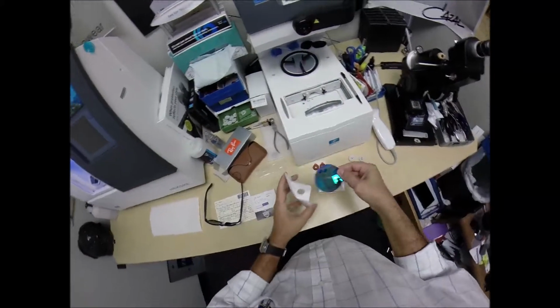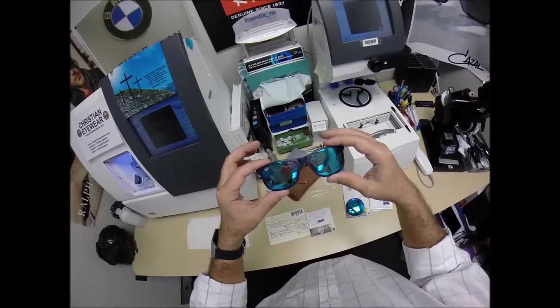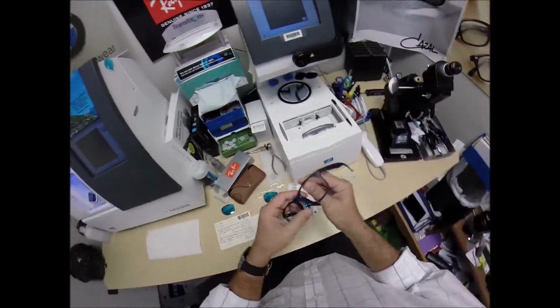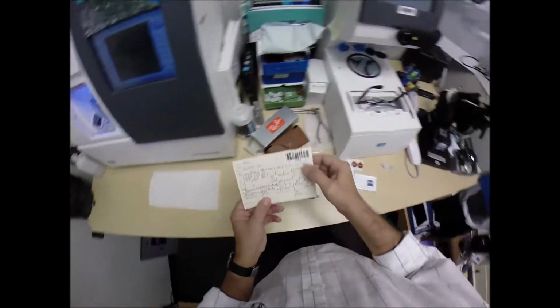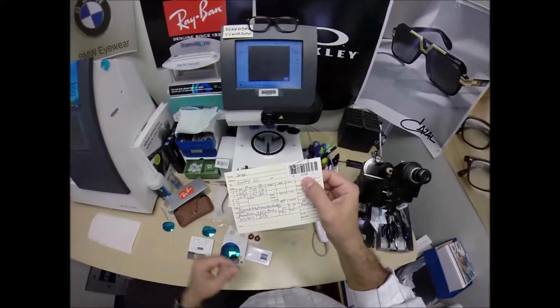I'll go ahead and leave that one out. I'm going to pop out the original demo lenses that you will receive. And I'm going to put your frame into the tracing element of my blocker, program the shape into the computer so that years from now, should you ever need new lenses for this frame, I can mail them right to your home.